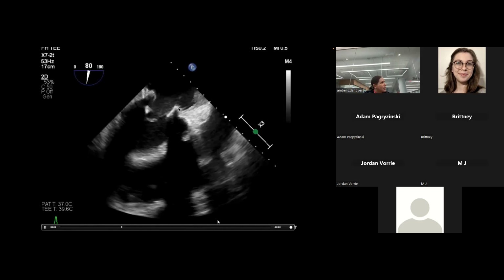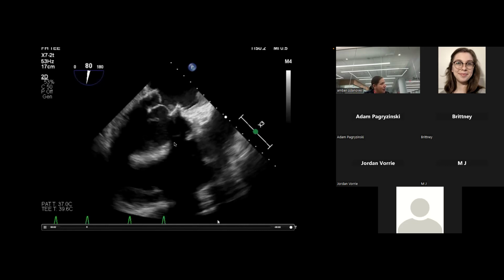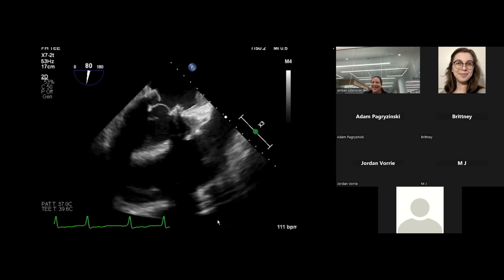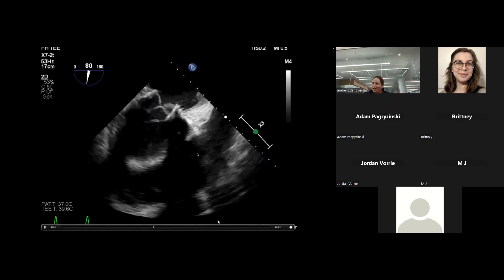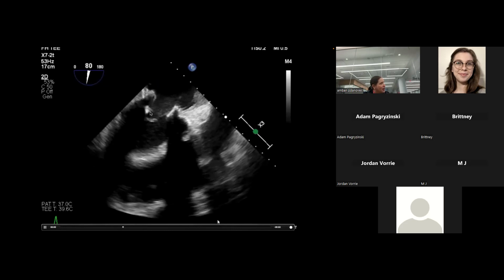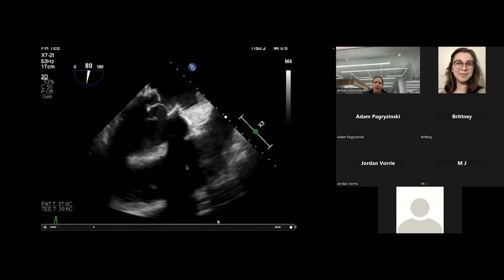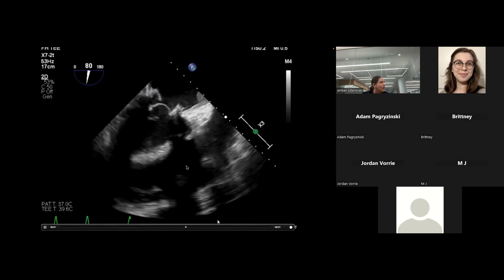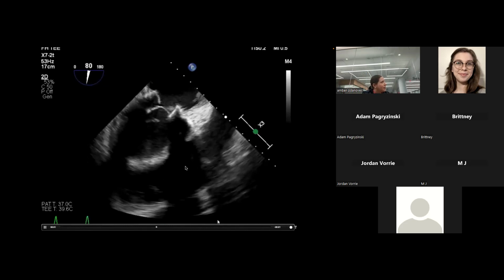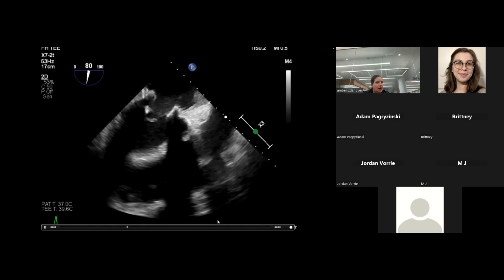The other thing is, do we remember what this artifact is? When the beam comes down, hits here, and just reverberates back rather than coming through, and you get this dropout. With the mechanical valve, because the leaflets are also metal, instead of this, which is pretty fixed because it's right on the strut, with mechanical leaflets you'll actually get that artifact that swings, because it'll change as the leaflets move. So that's another key to look for between bioprosthetic and mechanical. If you saw a swinging artifact as the leaflets open and closed, it clues you in that it's more mechanical. All right. But even with a bioprosthetic valve, you can see all that dropout makes it hard to visualize.